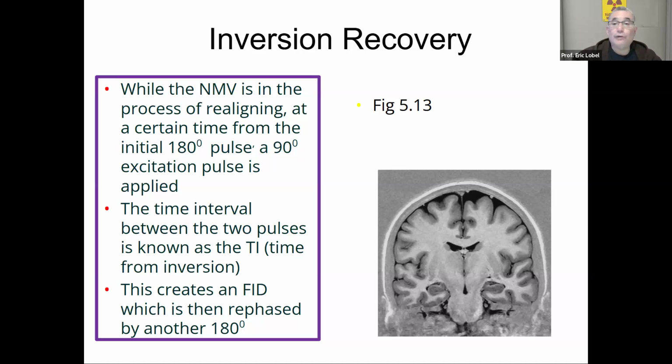The other one is STIR, which is for fat suppression, and it's a short tau inversion recovery. Again, at the end of the word, IR. So they're both inversion recovery sequences. Just one is for fluid, and when we say fluid, we mean blood or CSF, essentially. And when we say fat, we mean fat.